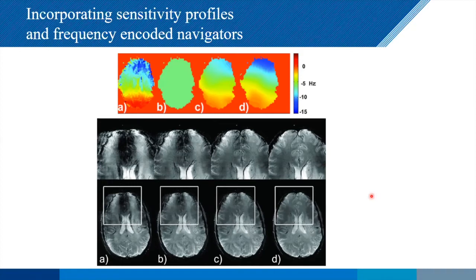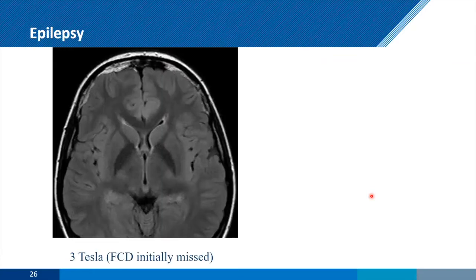And so we over here then concentrate on 3 or 4 different applications in the clinic. So the first one is epilepsy, which a lot of 7T sites do. And if we look over here, this is a 3 Tesla scan. There's a cortical dysplasia here, which is not easy to pick up, which was actually initially missed by the radiologist, but clearly the signs are there in terms of the patient characteristics.